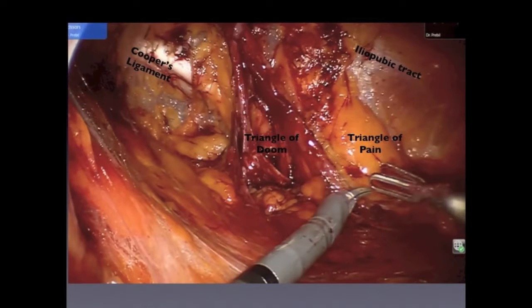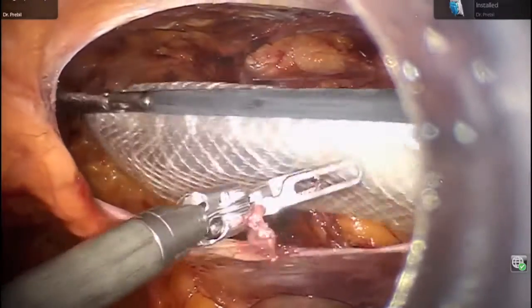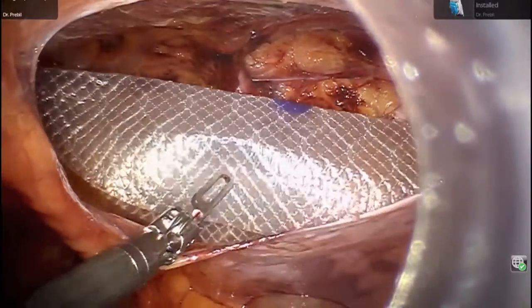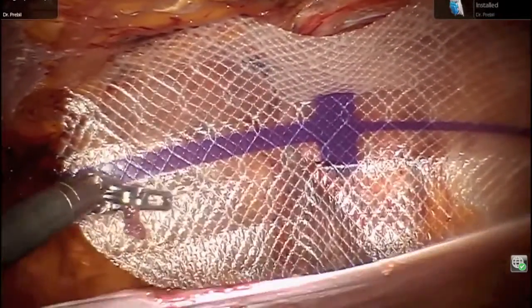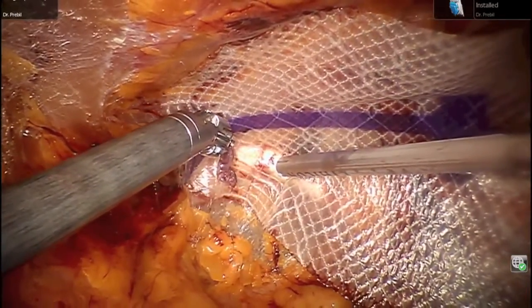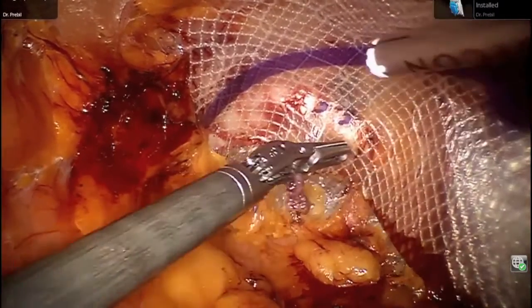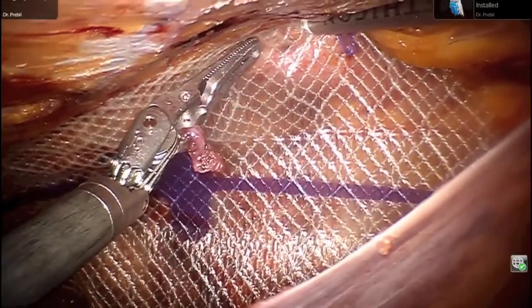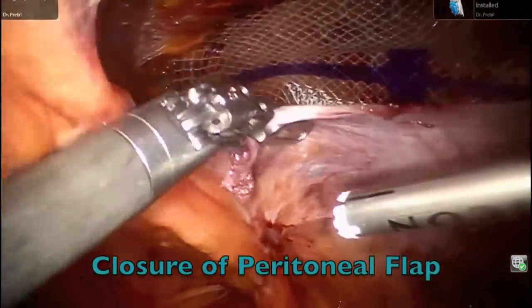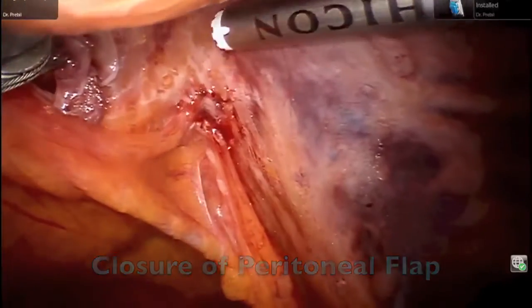Tacks to secure the mesh are placed medially on Cooper's ligament and laterally above the iliopubic tract, in order to avoid the triangle of doom as well as the triangle of pain. The eight-millimeter trocar ipsilateral to the hernia defect is then undocked and the assistant deploys the mesh through this trocar into the inguinal space. Tacks are placed on Cooper's ligament, above Cooper's ligament anteriorly, and a tack in the superlateral position. The peritoneal flap is then closed with a tacking device.